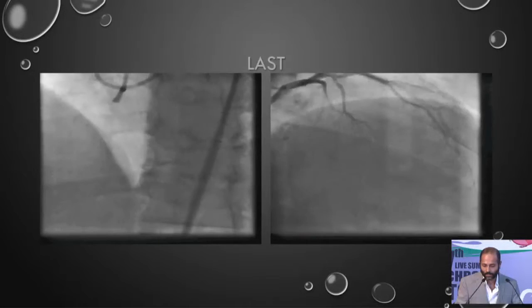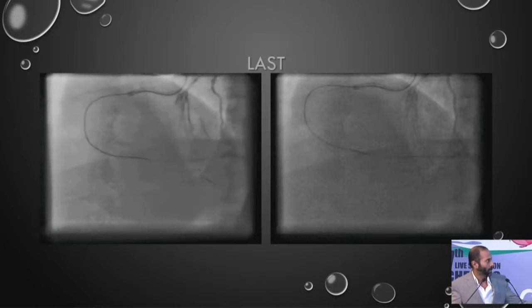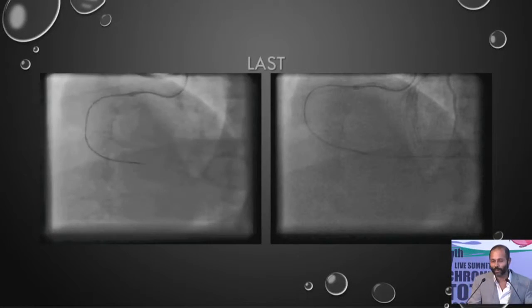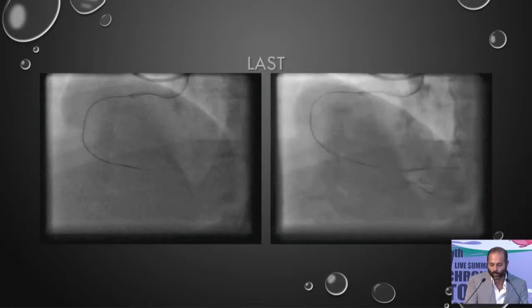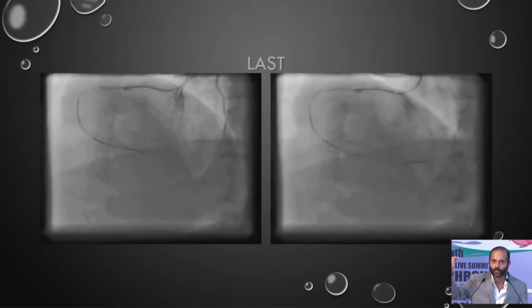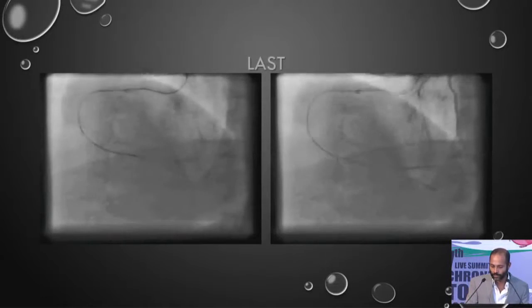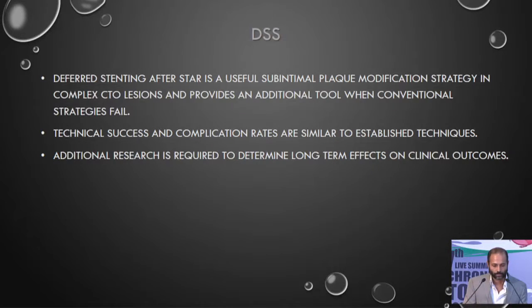This is just one case showing LAST. It's from a few years ago. And all I really want you to pay attention to is just the tip of the wire. Oftentimes it uses a penetrative wire. You could use the Hornet 14 or a CP12, which is what we used to use. And the key difference is instead of the typical CTO bend, you put a 2 to 3 millimeter bend, 45. So it's more of a re-entry bend that you want to use. And again, it works in some cases.